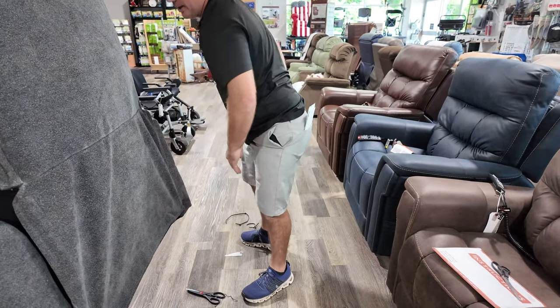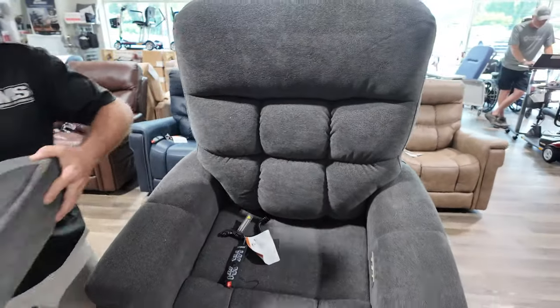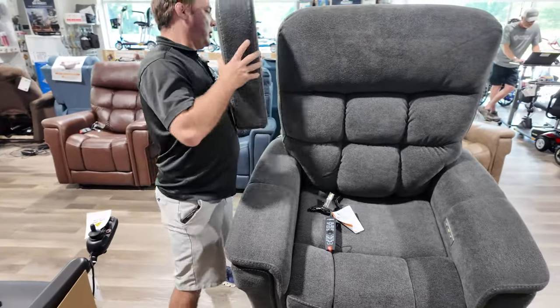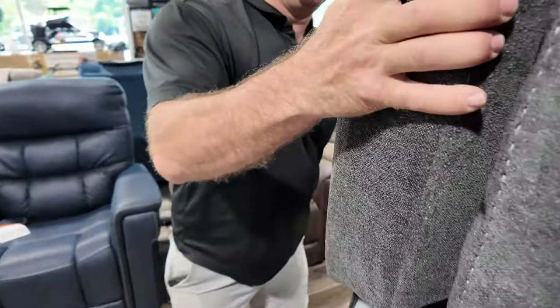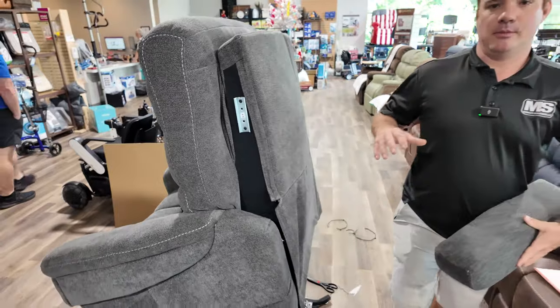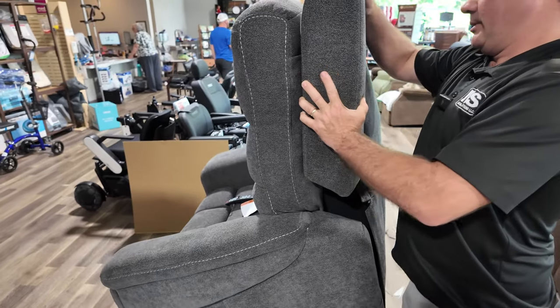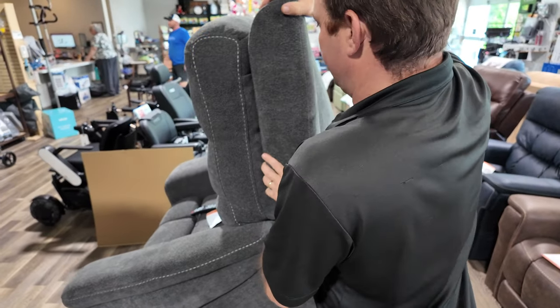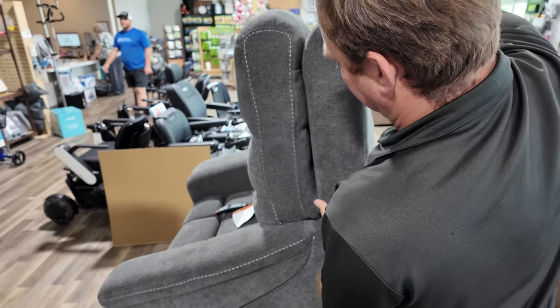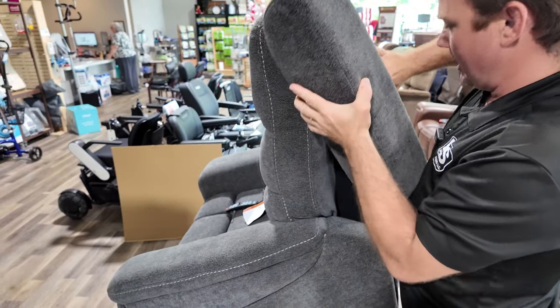We've got to put the backs on — see, those are missing. We've got to add some character to it real quick. Number one comes over here — it's labeled, just get it to connect. Then number two. This is the large, just so you know — they also make this in a medium and a small in the PLR4955. Let me show you something, so I'm going to take that off and make sure nothing's in the way.